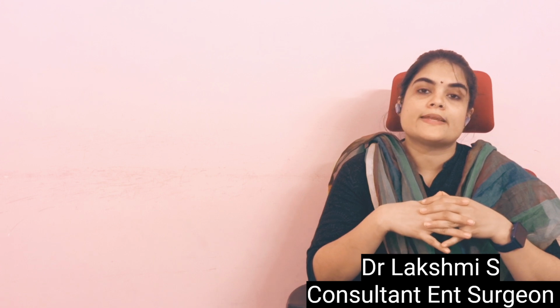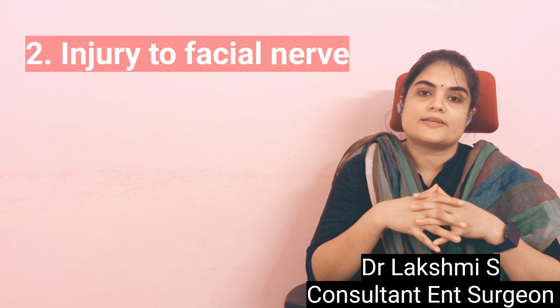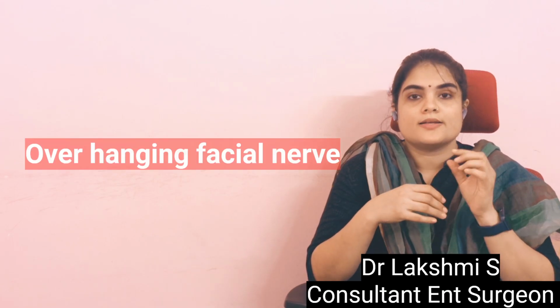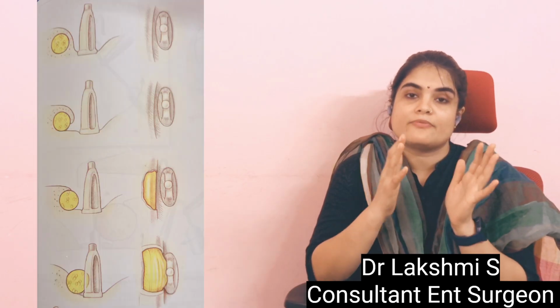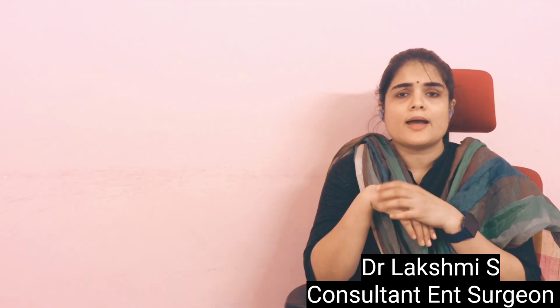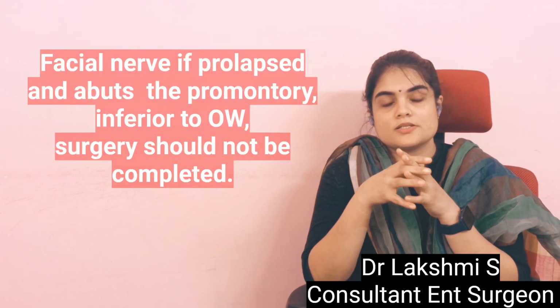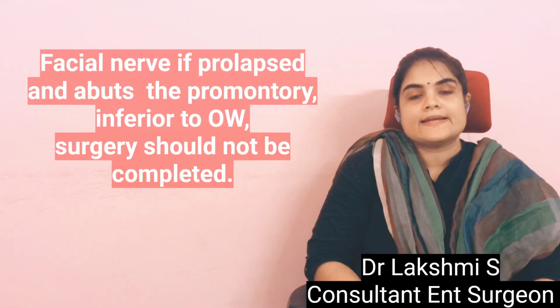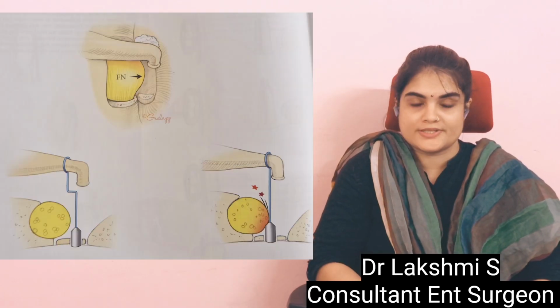Another problem is any injury to the facial nerve or an overhanging facial nerve. Usually the facial nerve canal can be dehiscent. A small area can be dehiscent, or it can be completely dehiscent, but the facial nerve is within the canal. But sometimes the facial nerve can overhang or prolapse outside the canal and abut the promontory inferior to the oval window. In that case, if such a condition is found, we have to abort the surgery. In a dehiscent facial nerve, you can use a double bend technique, where the piston is bent on both sides, and then the surgery can proceed.